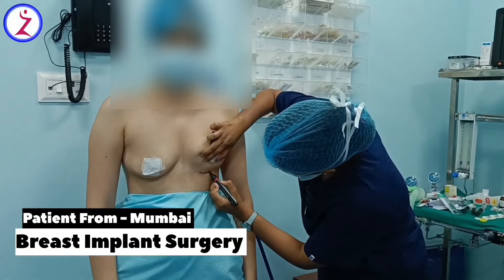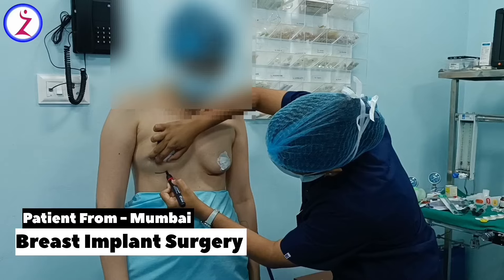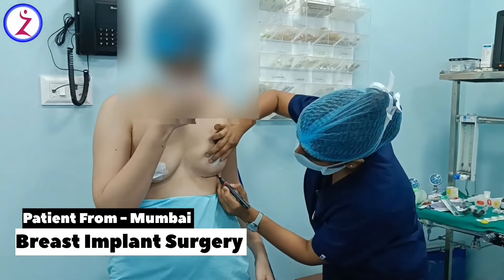Hello friends. As you can see in this video, this is our 28-year-old patient who came to Mumbai just because of her small breasts and has had breast implant surgery.